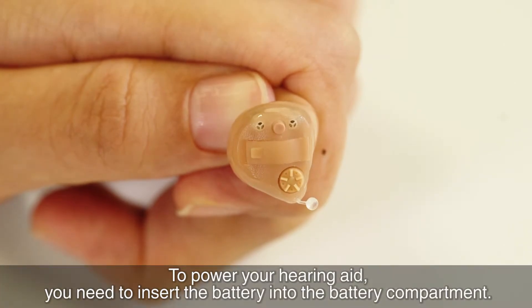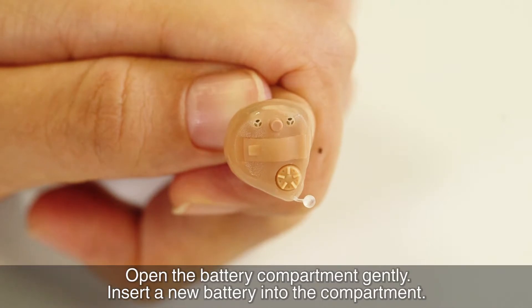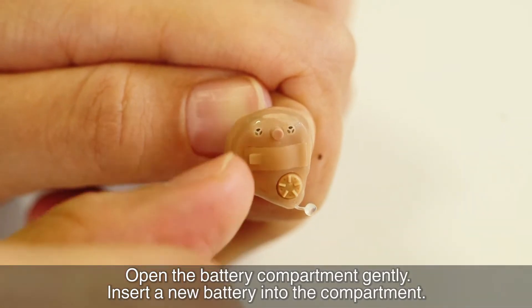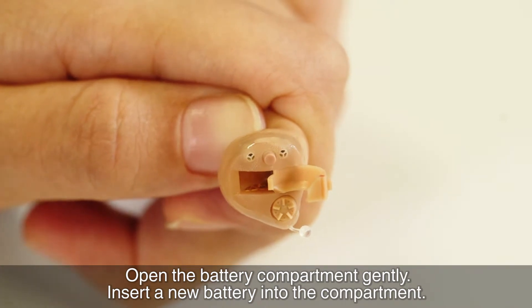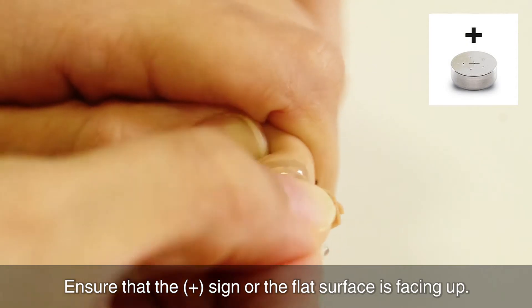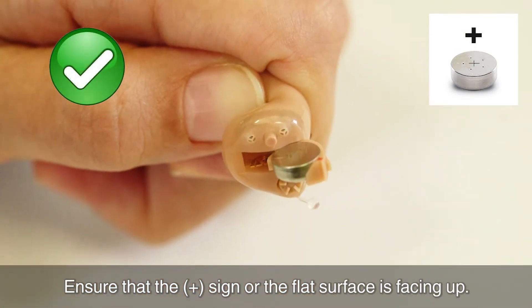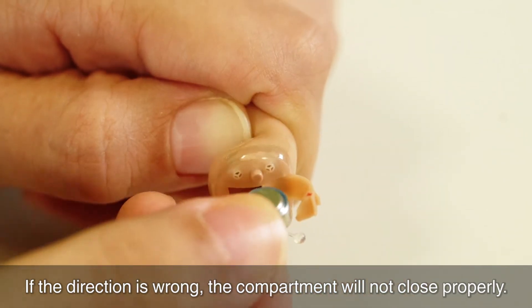To power your hearing aid, you need to insert the battery into the battery compartment. Open the battery compartment gently. Insert a new battery into the compartment. Ensure that the positive sign or the flat surface is facing up. If the direction is wrong, the compartment will not close properly.